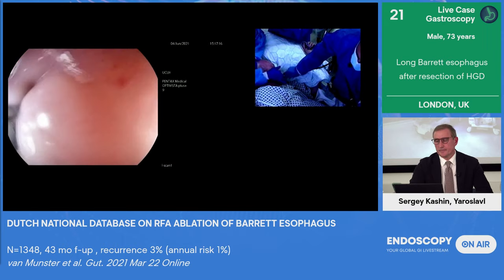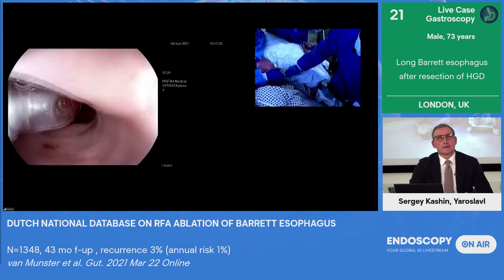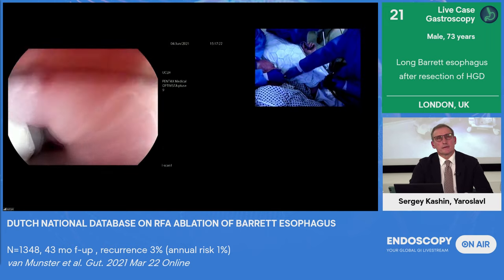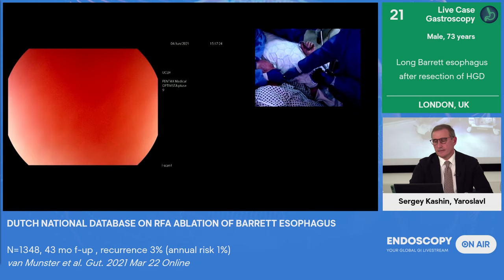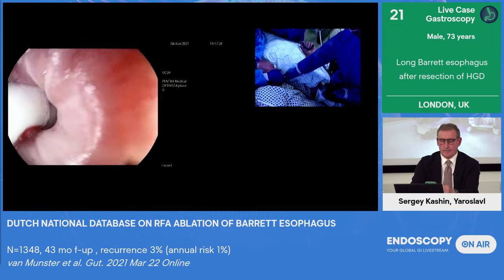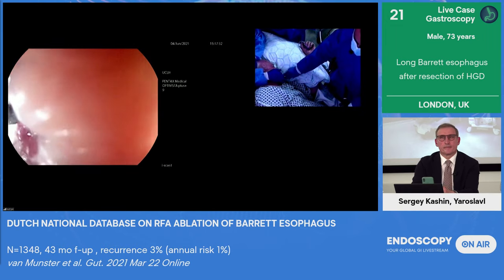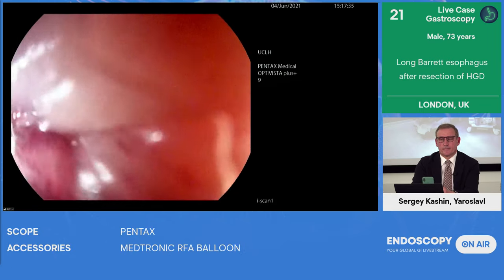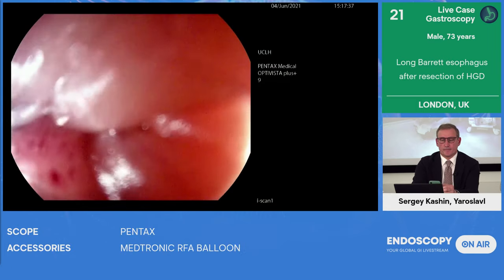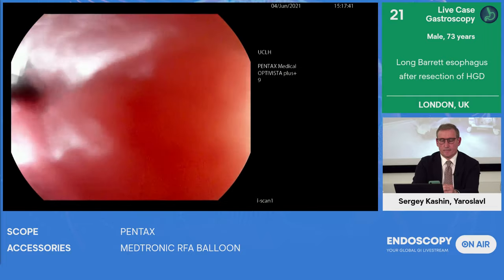Just expand the balloon. Okay, great. Got a steady position. Let's do the first ablation now. Yes, sir. Just going to inflate the balloon. And we're going to be using 10 joules in terms of dosimetry, which is automatically put onto your machine. And once you hear that constant ping there, you're ready. Show us the balloon, Vinay, expanded, please. I'll show you the balloon now.